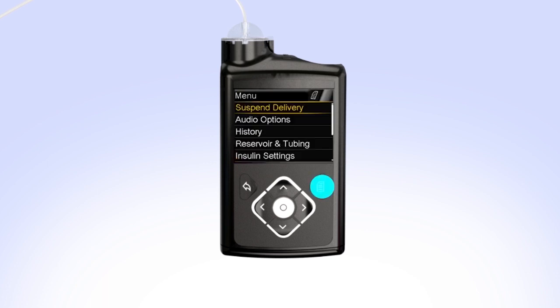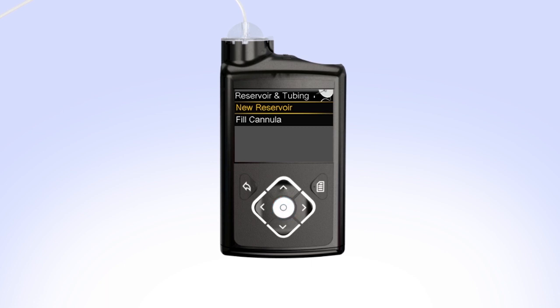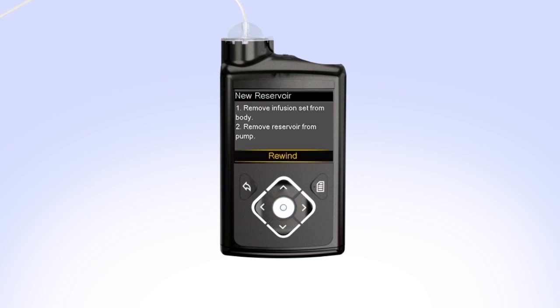To begin, press Menu. Then press down to Reservoir and Tubing and press Select. Select New Reservoir. The pump will instruct you to remove the infusion set from your body and to remove the reservoir from the pump.